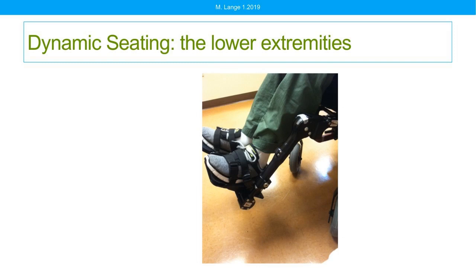All right. Well, we have a couple questions there. Let's go back to those questions here. We have one question, do all dynamic systems need to be locked during driving? It is recommended that a dynamic back be locked during transportation. The dynamic footrests really don't lock, neither do most of the dynamic head supports, but the backs do. So typically those are locked during transport, and then unlocked when you get where you're going. That's a real problem. Sometimes they don't get released and the client can't move.